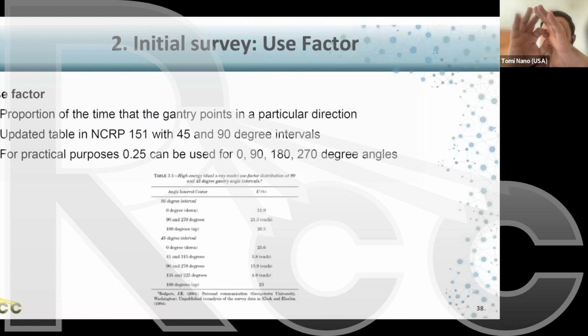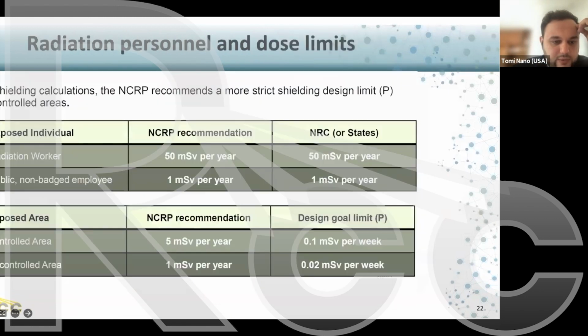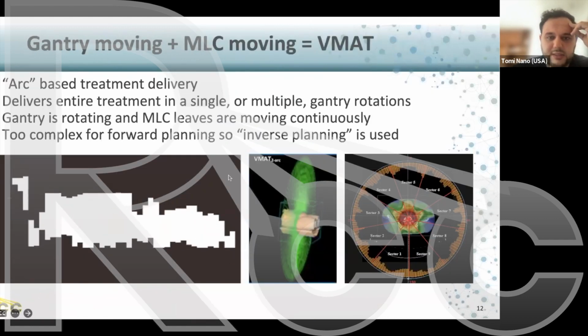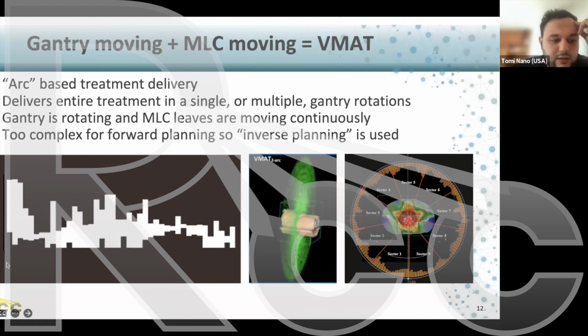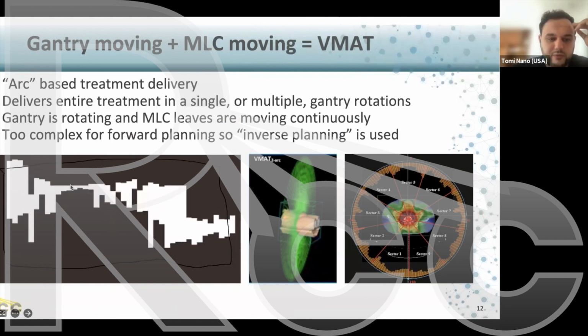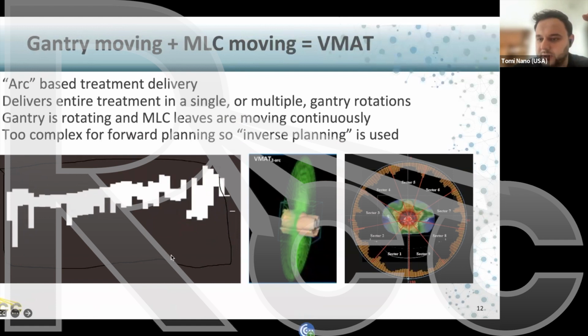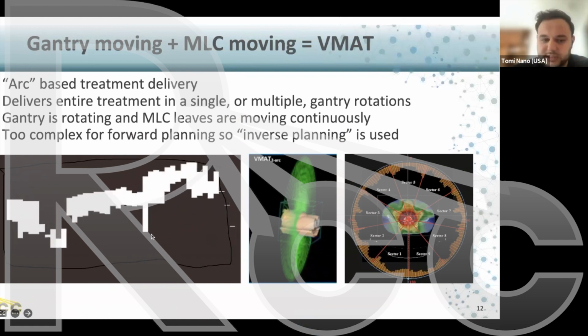But now that you have an MLC, let me just show you. I had that GIF. Basically, if this entire area was open, let me annotate. If you had a cutout that was just a square, and you delivered 1 MU through here, this entire area would receive 1 centigray if your machine was calibrated for 1 MU to 1 centigray.